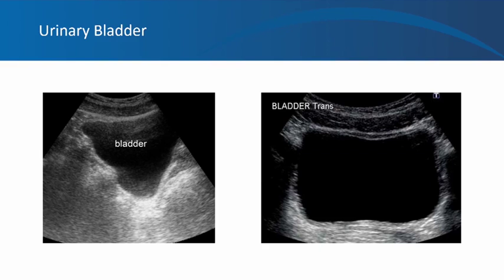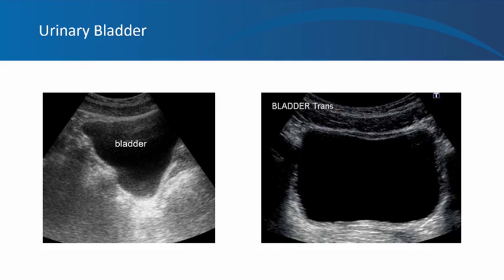On ultrasound, the urinary bladder is a fluid-filled structure. When filled with urine, it appears as a black structure with an echogenic border. In the sagittal view it is roughly triangular; in the transverse view, rectangular. You should not evaluate lesions arising from the bladder wall unless the bladder is filled with urine — if completely decompressed, you cannot evaluate its characteristics.